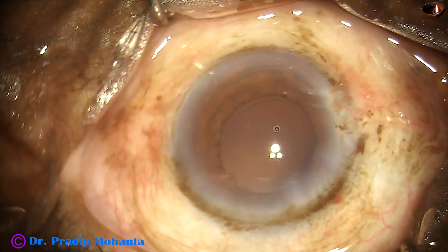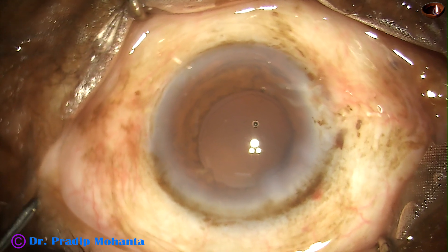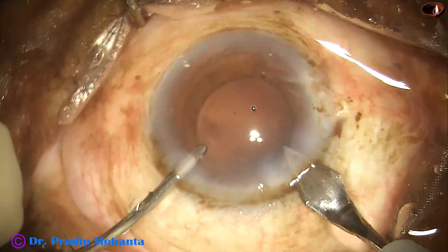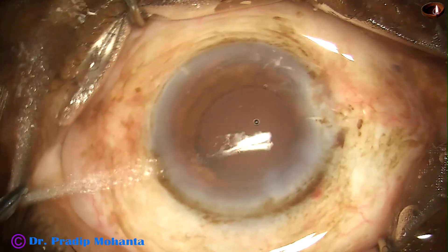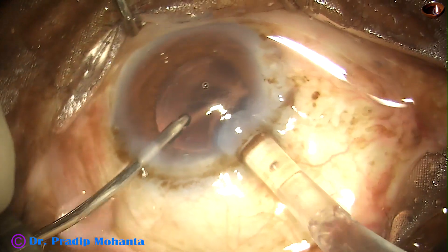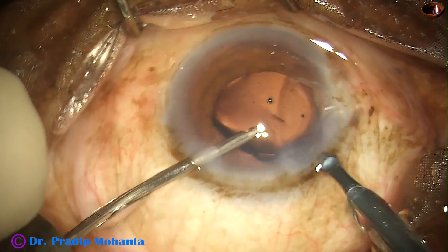In this case we have selected a hydrophilic acrylic single-piece aspheric intraocular lens. I am using a B-cartridge, so I am going to enlarge the incision a little bit, by about 0.2 mm. And here goes the intraocular lens — this is NASPRO from Apa-Sami Associates.